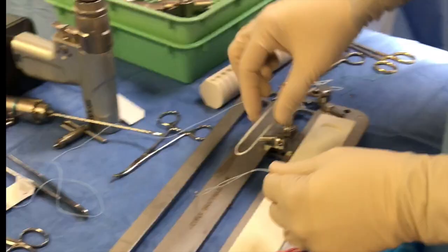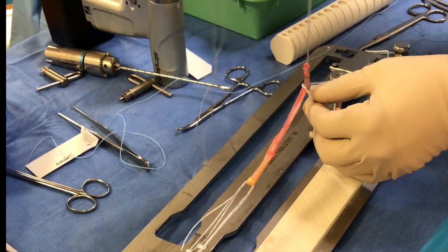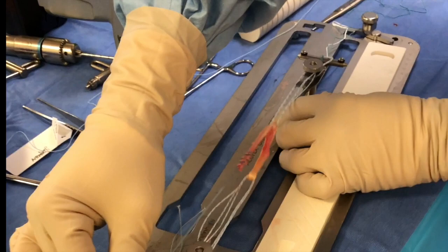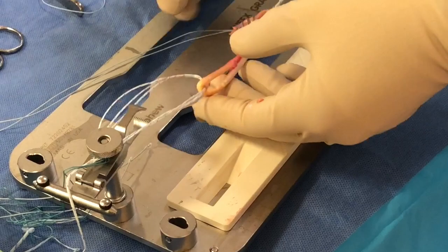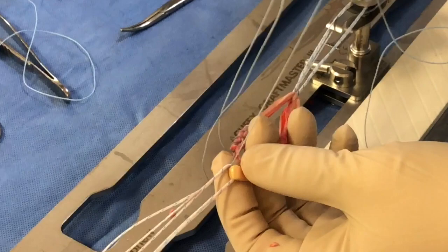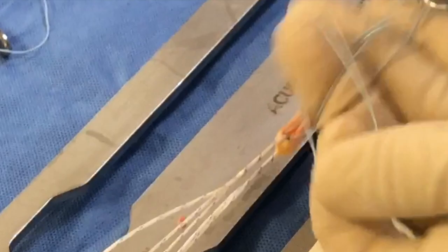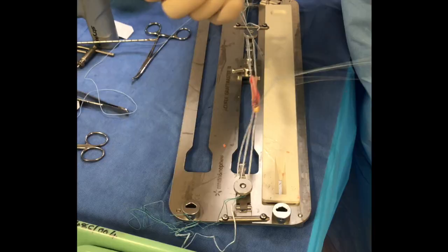What you end up with is a graft that's fixed at one end. Next, you loop the graft into the other graft prep and set it roughly at the halfway mark — this makes it into a four-strand. Then loosen off the graft and fix the tail of the graft into the loop so that it comes right on the apex of the button. Fix that right up against the edge, making sure the graft is tied firmly to the end of the button.